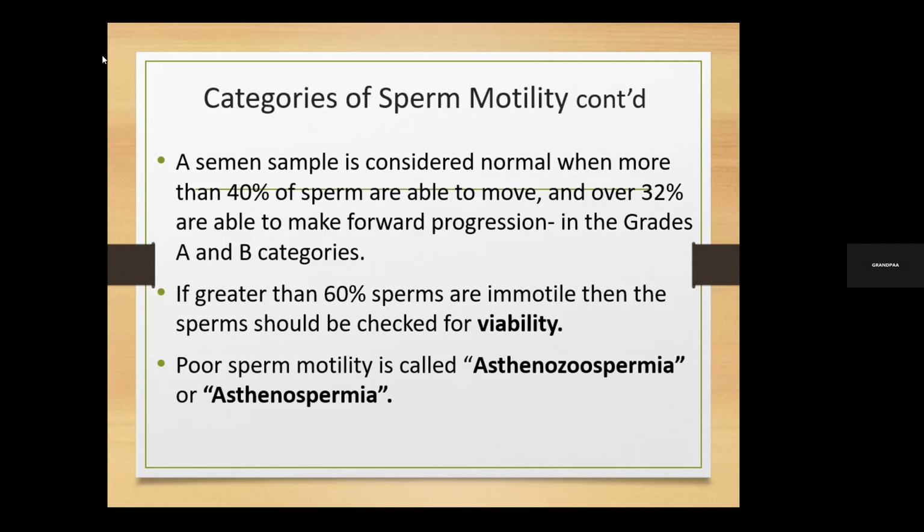Okay, so we are going to take you through the viability or vitality test, but it is not advisable. You don't need it for every test. Every test that passes the motility test, if you have more than 50% motile, 60% motile, you don't need the viability test. I hope that you are not confused.